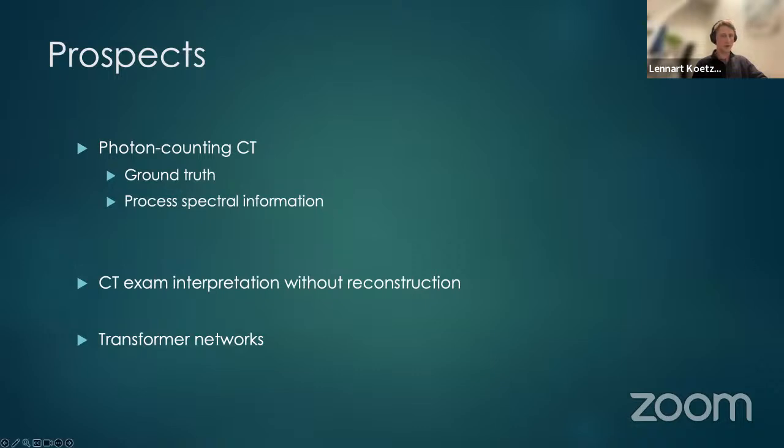And this is also what 2 studies looked at, and it had quite promising results. Alternatively, I also think it could help to make radiomics more reproducible, as the image reconstruction process has its influence on the CT values. So if we take away the reconstruction process, we also take away the influence of this reconstruction process on CT values, possibly making radiomics more reproducible.